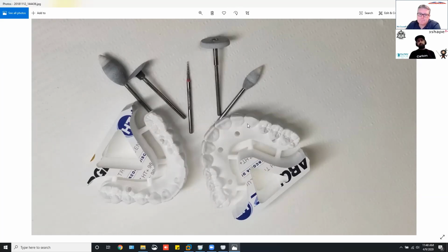But hey, if it works for you, continue. I'm not saying don't do it. Just saying be very cautious. Try it, but actually do two crowns, and try one and try one, not another. Then I actually increased my margin offset in my designs to 2 mil, like 2/10. So it was nice and thick, and with that I got longevity on my burrs.